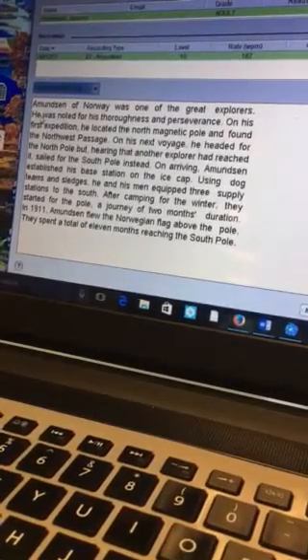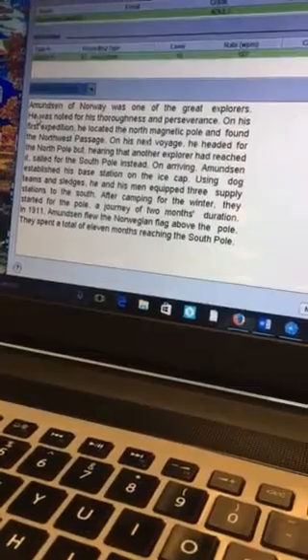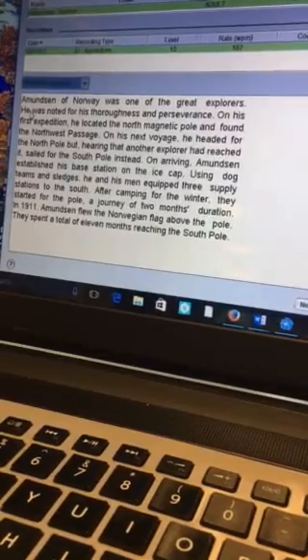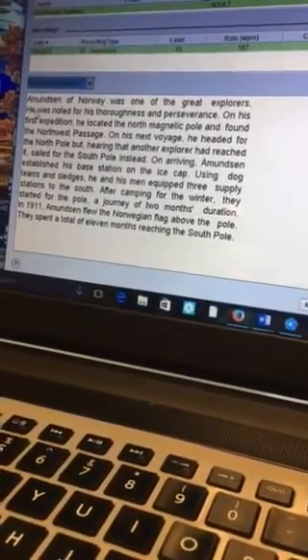Now we're going to watch your son's functional reading assessment. What this is, we asked your son to read a grade-appropriate, age-appropriate passage, and he was wearing a pair of infrared goggles while he read the passage. And what the goggles do is they track his eye movements as he reads.